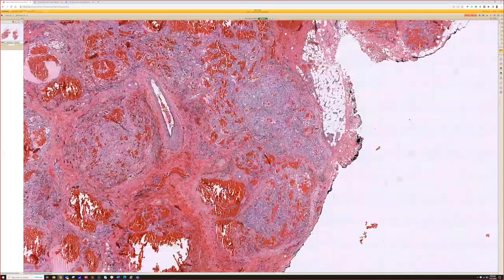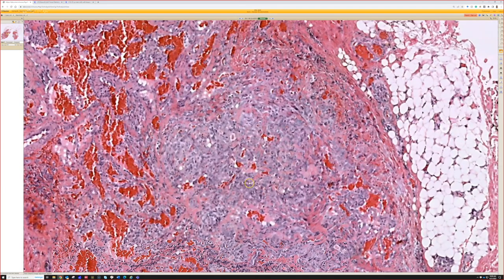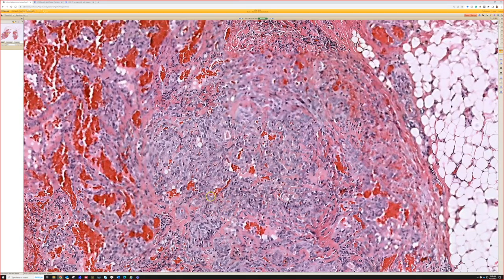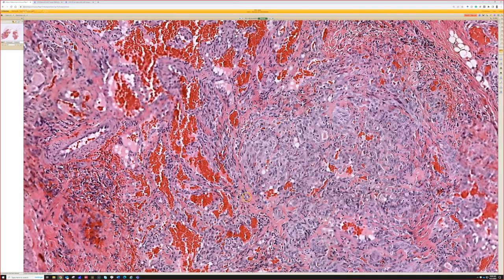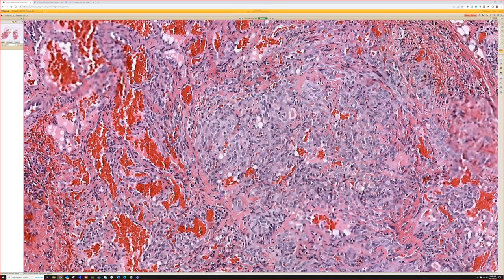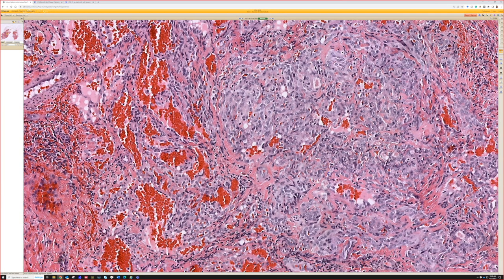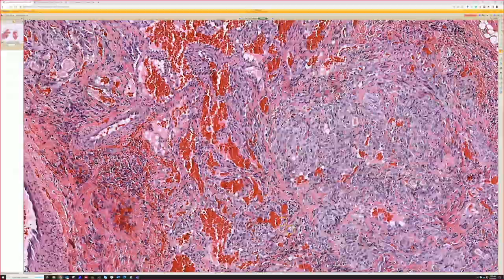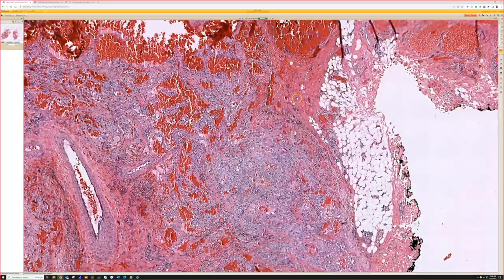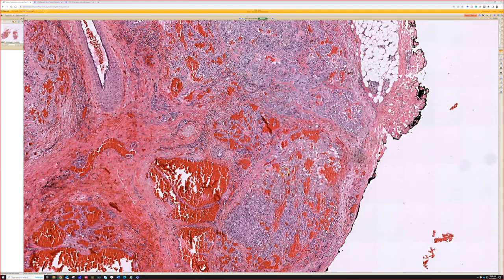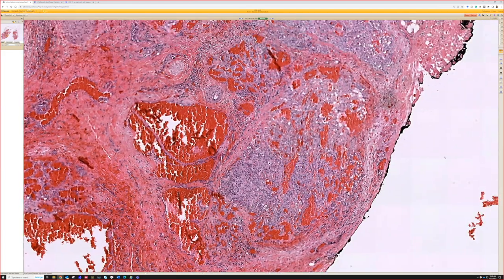Moving over to another area, this doesn't look as cavernous — it's more like almost solid nodules that are cellular. Both spindly on the left and epithelioid-looking on the right. So, do you have ideas? How will we put all this together? What is this thing called?